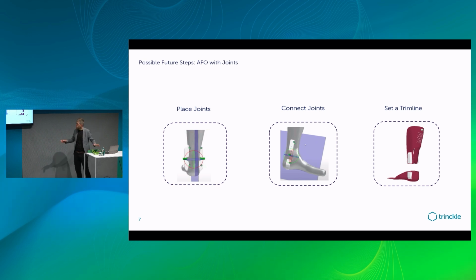And here you see a little bit how this works. So you basically select some axis, you orientate it in walking direction, you make sure that the rotation point is correct, and then it places those pockets exactly on the outline of the functional form, and then you set the trim line accordingly.